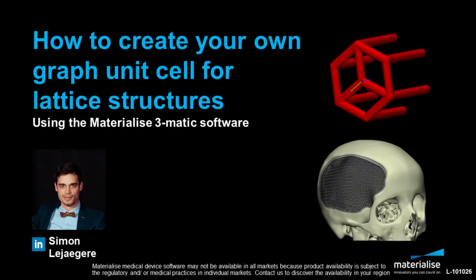Hello, my name is Simon and I'm a medical application engineer at Materialize. In this video I will show you how to create your own graph unit cell for lattice structures using the Materialize 3-matic software.